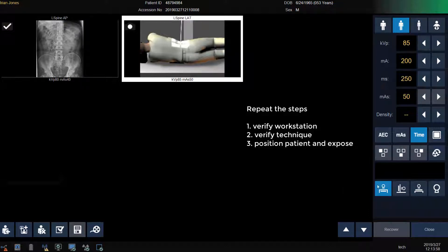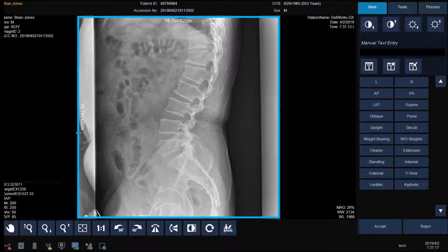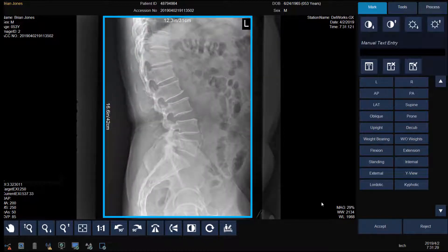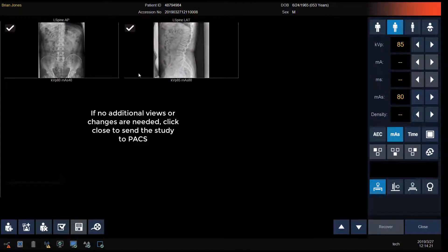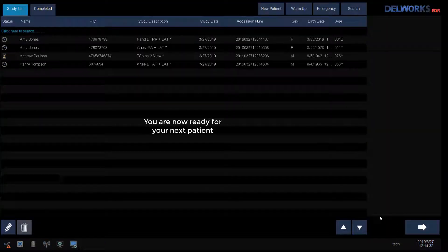Select your workstation. Modify your generator settings if needed for patient size. Position your patient and make your exposure. The second image is displayed. Crop, add a marker, flip the image, and then click Accept. If no additional views or changes to the images are needed, click the Close button to send the images to PACS. The study will be closed, images sent, and now we are ready for our next patient.